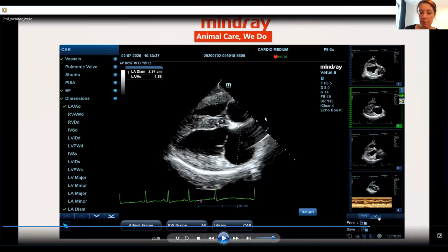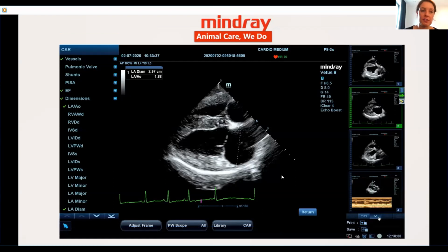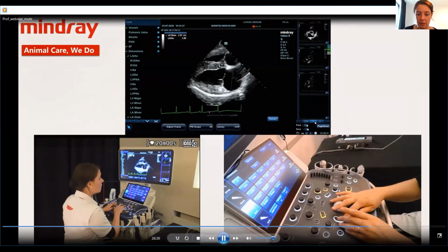What I want to say here is that this measurement is particularly useful in cats. When you want to assess left atrial size, when you want to decide whether a cat has dyspnea from cardiac origin or from respiratory origin, it's always a good idea to do this measurement, because when you begin to do cardiac ultrasound it's often more reproducible and easier to measure than the LA/AO. The cutoff for normal left atrial size in cats is approximately 16.5 millimeters, okay? This is a dog, so it's allowed that this dog has a bigger left atrial size. Okay.